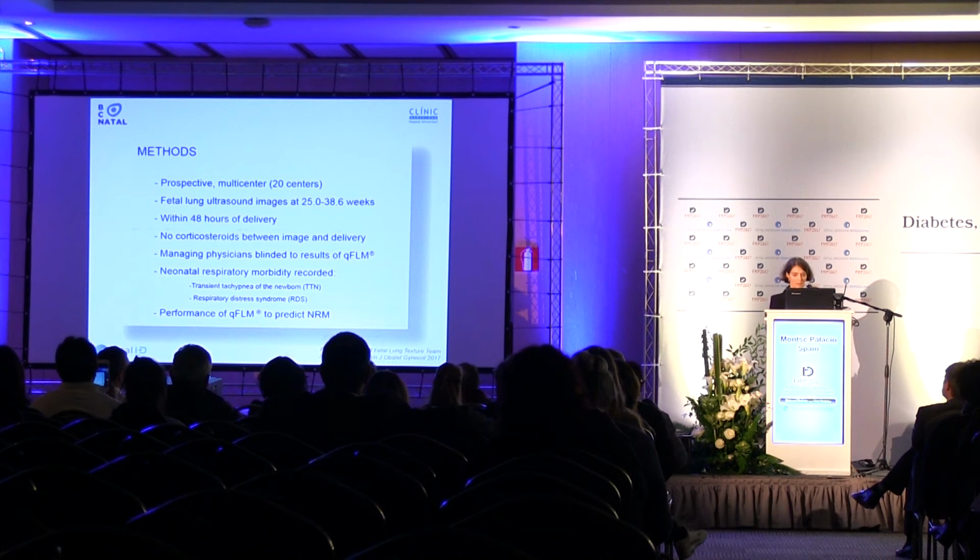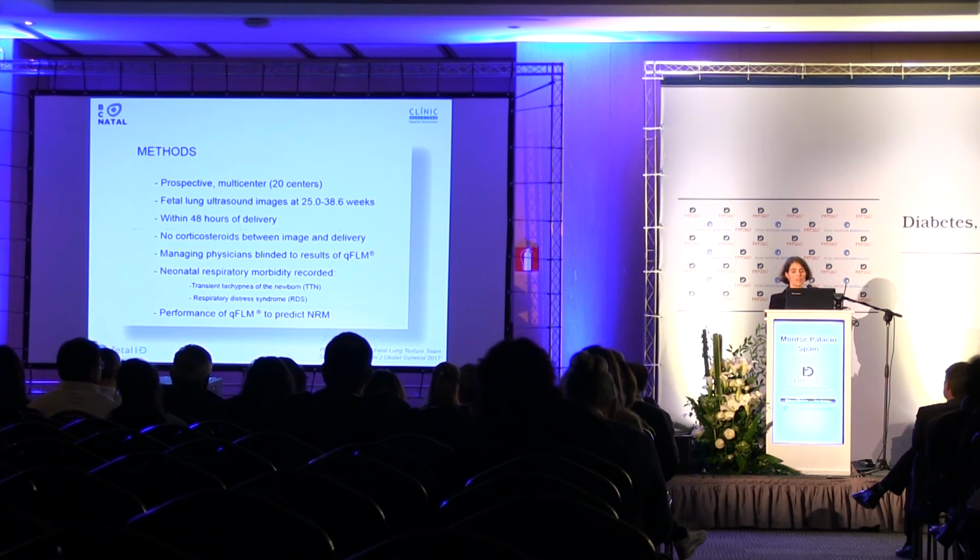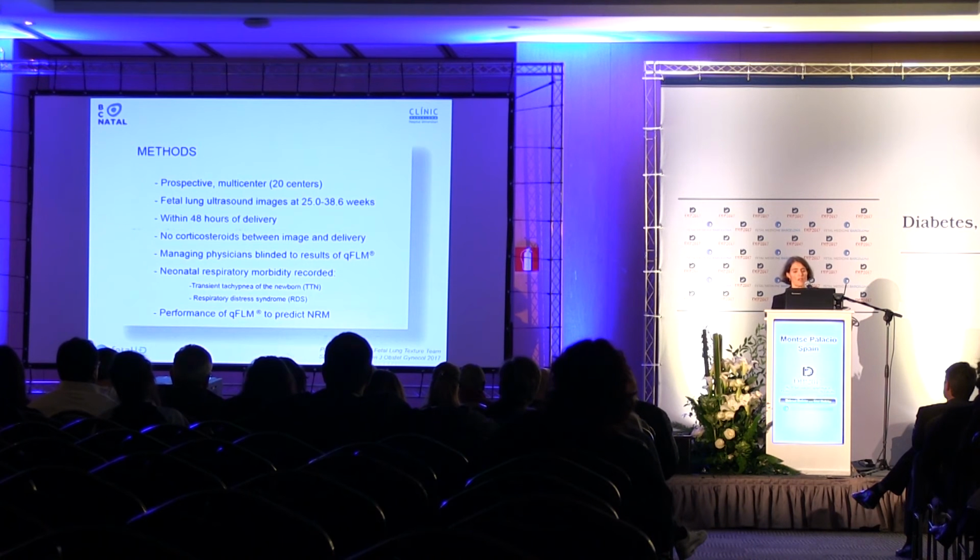So we did this prospective study that was multi-center and multinational, and we were obtaining ultrasound images from 25 weeks to less than 39. The image had to be taken within 48 hours of delivery, with no corticosteroids in between the image and the delivery.